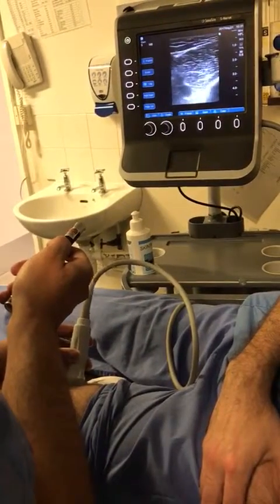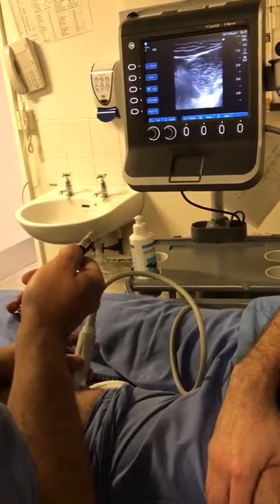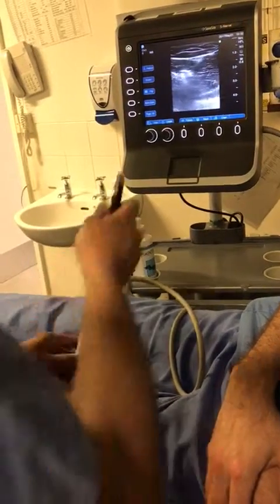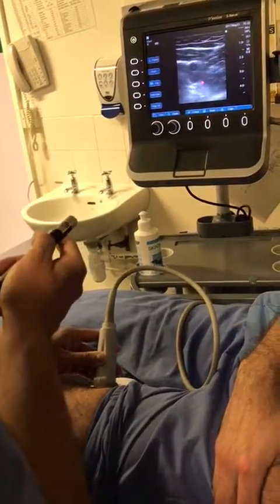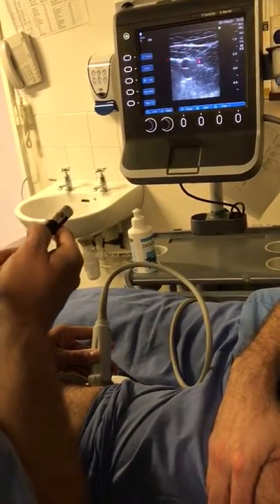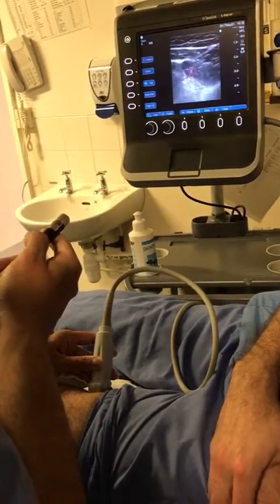And I'm looking for a vessel. That's my superficial femoral artery along with the vein. Let me just go up and make that vessel look much more clear. So you can see the sartorius there, you can see the superficial femoral artery, superficial femoral vein.